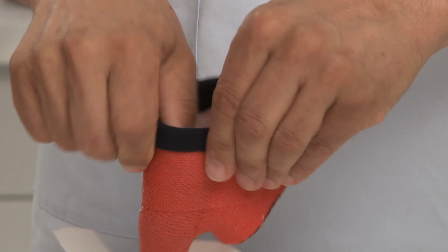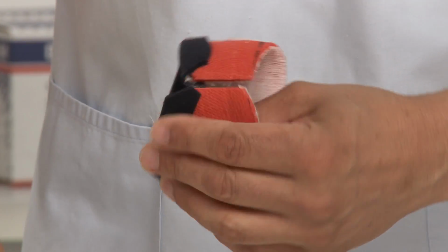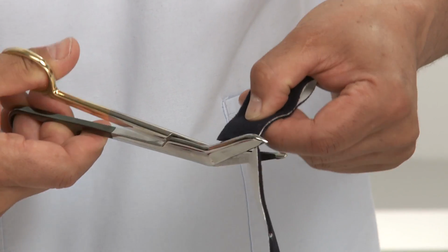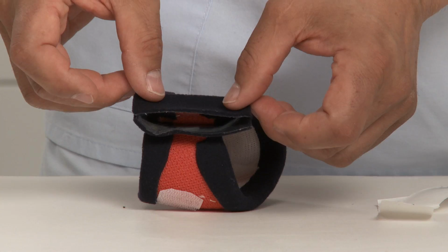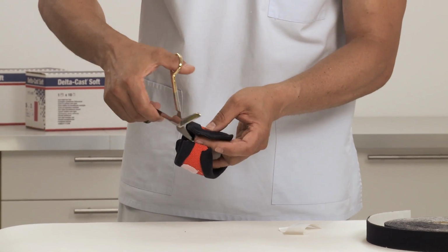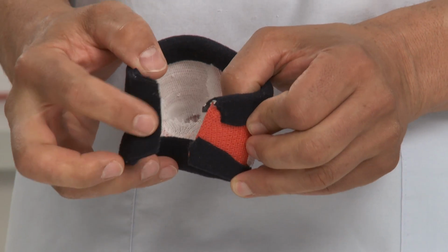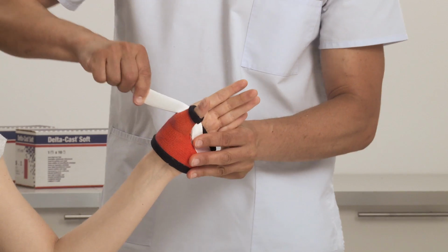Take cast off again and apply fleece edger on the distal and proximal cast ends to get soft edges for a comfortable fit. To avoid the skin getting pinched on the main cutting edge, apply a doubled-up adhesive fleece edger. Place cast on hand and attach stretch loop to secure the cast.